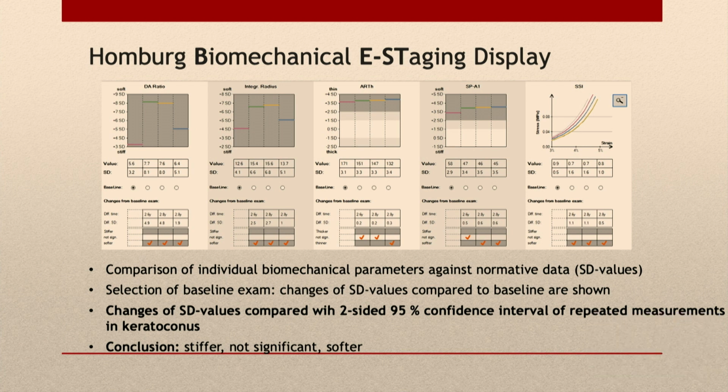So you remember, the ABCD is not like saying, well, we have the ABCD, then we don't use tangential map anymore. You just add something. And then because you need the single parameters to judge the cornea after cross-linking. And then I will tell you in a second how to use it.